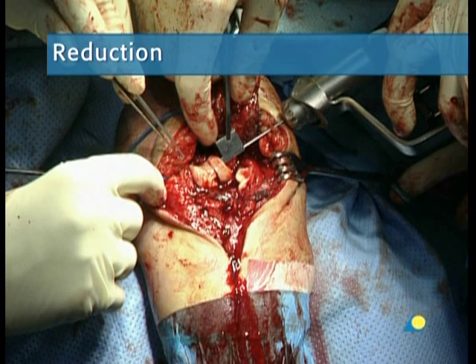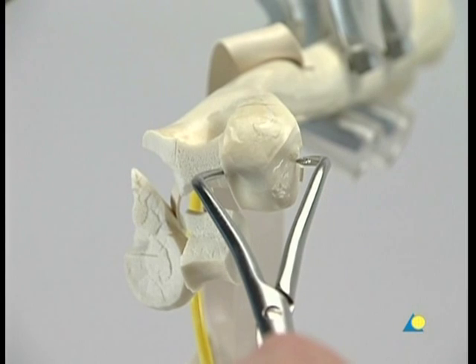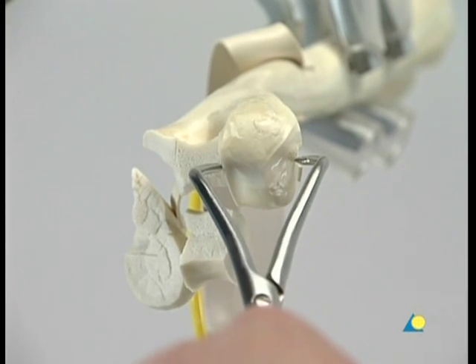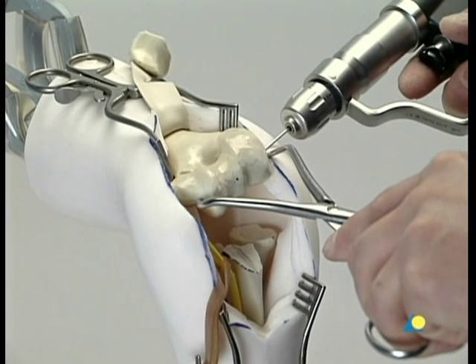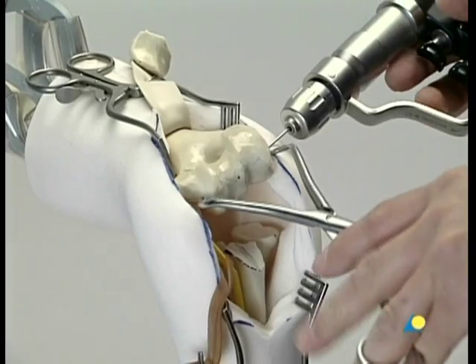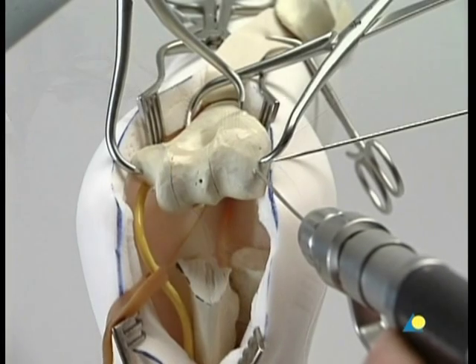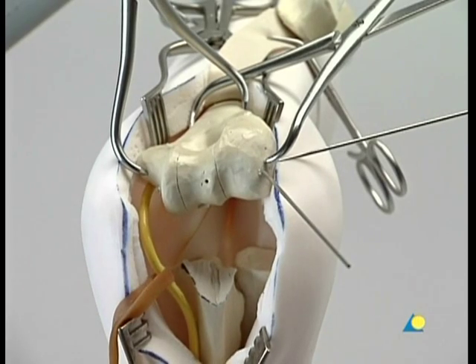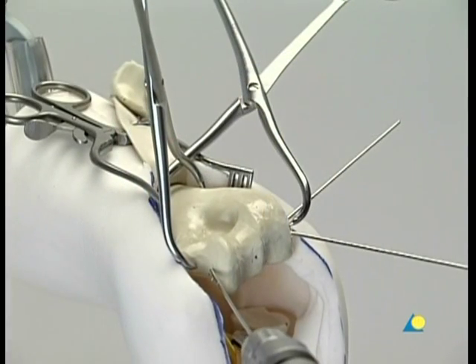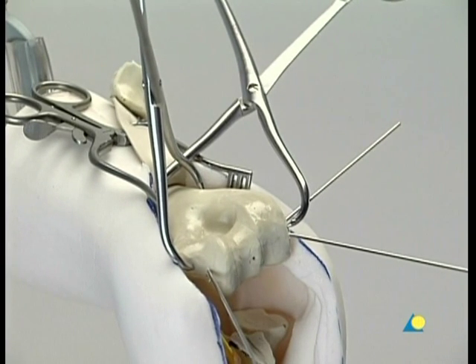For C-type fractures, the articular fragments of the distal block are reduced first under visual control and fixed temporarily with K-wires or the pointed reduction forceps. The distal block is then fixed provisionally to the shaft using K-wires or the pointed reduction forceps in both columns. The fracture has to be reduced anatomically and compressed before the locking head screws are introduced. Because the design of the screw does not permit additional compression, the correct reduction of the distal humerus is verified.